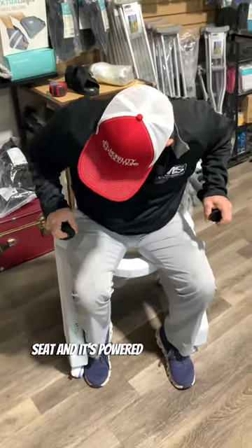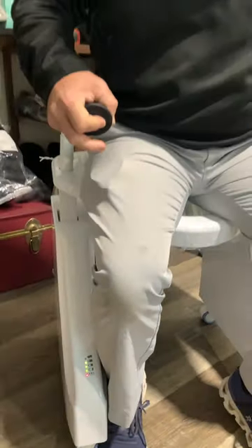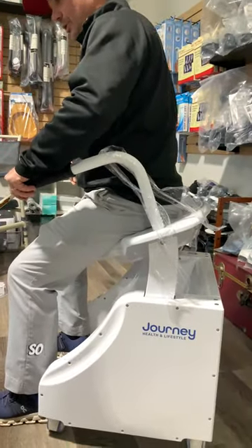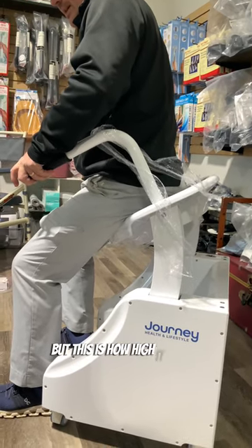And it's powered. You press this and it comes up — there's your battery indicator. It's rising you like a lift chair would, and you can stop it wherever you want. This is how high it comes.